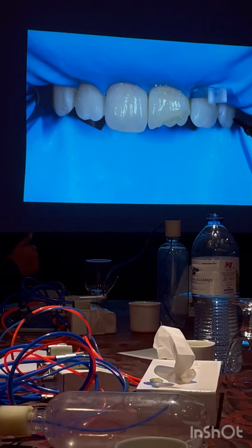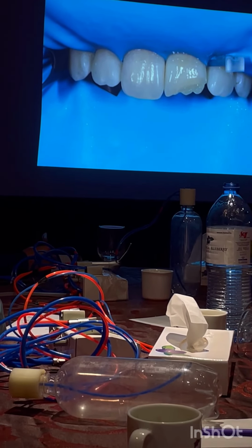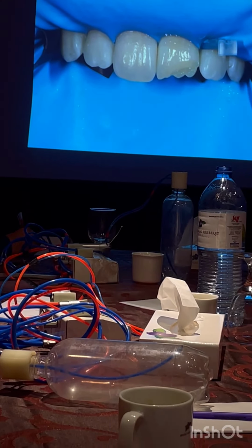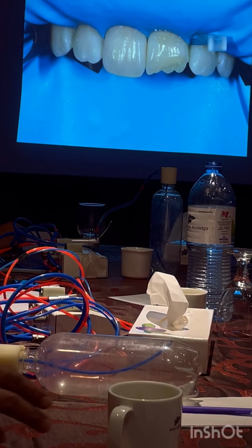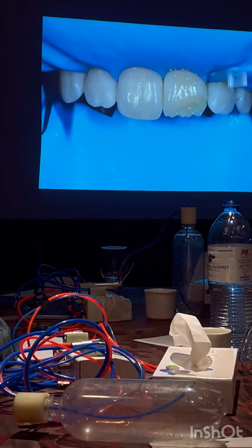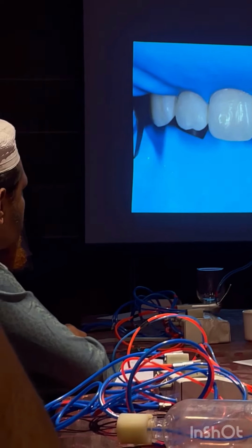Okay. So now for class 4, what is my challenge? I need to get my lingual plane. My first increment will be from the lingual side to get my lingual wall. So I use my composite like a ball. I place it from behind and I keep pushing my composite with my instrument. It comes front like this and I create a lingual wall. This lingual wall is created with enamel shade because what is behind is enamel. Yes. Only 0.5 millimeters enamel.